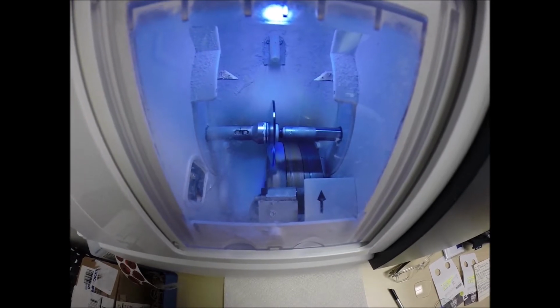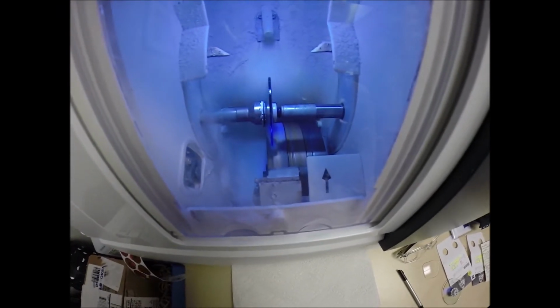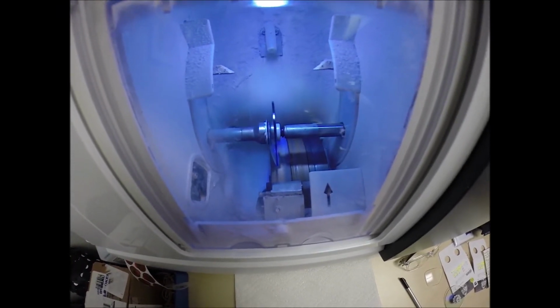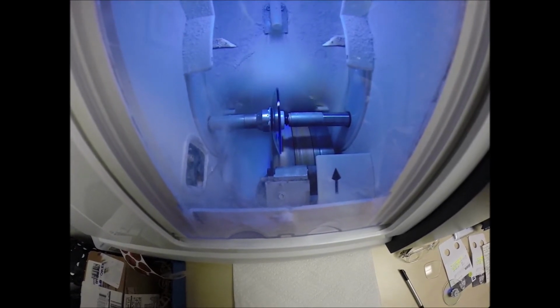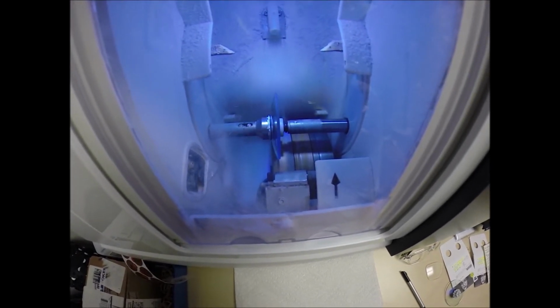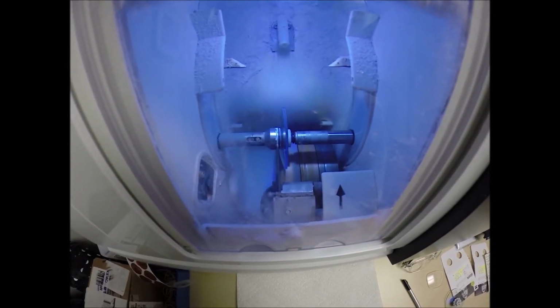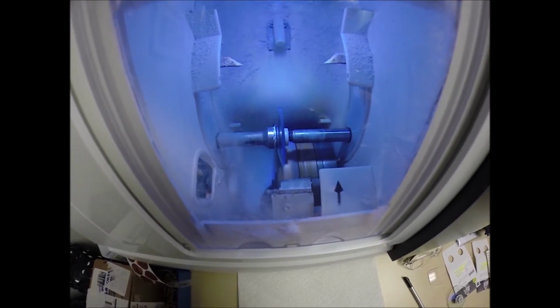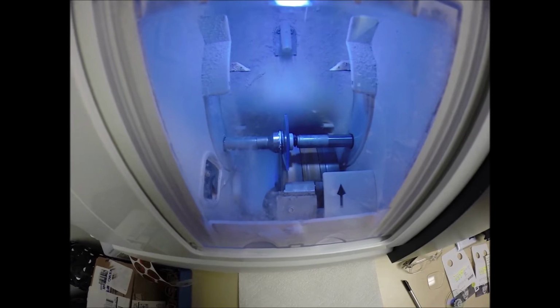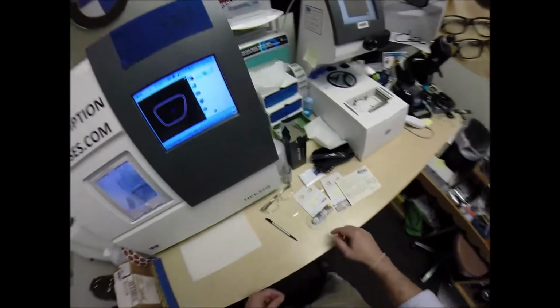Now the water that you see flickering in the background, that's there to catch the optical sawdust. If this lens ever touches down on the cutting wheel, there will be optical sawdust. But polycarbonate lenses cut dry, meaning that no water sprays onto the lens for the cutting cycle, unlike plastic, high-index plastic, and Trivex that do cut wet, meaning that water sprays on the lens the entire time. Now water will spray onto your lens, but only to wash away any optical debris that you may see beginning to form on the edge of your lenses.